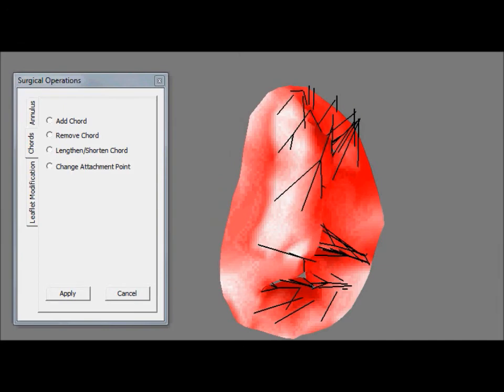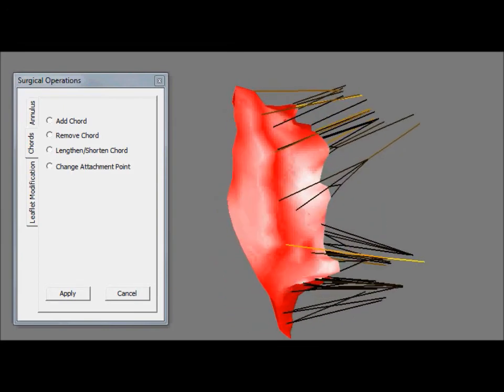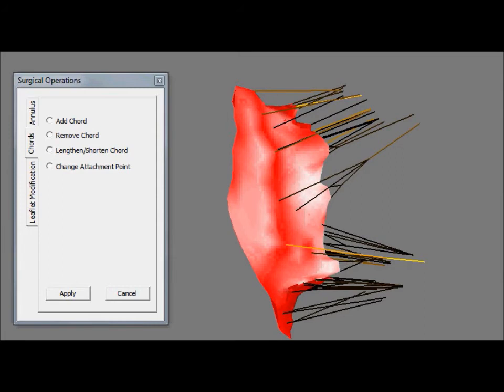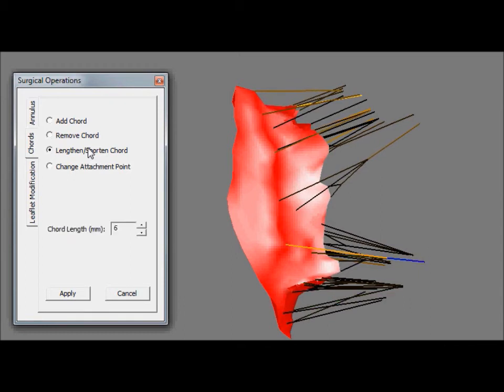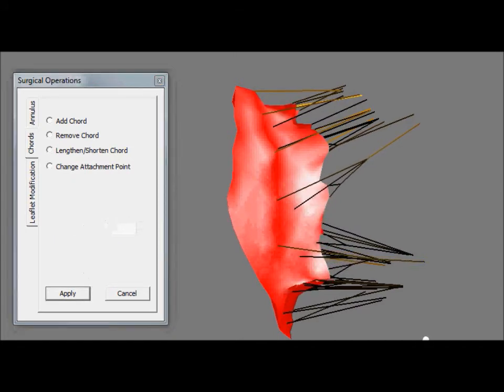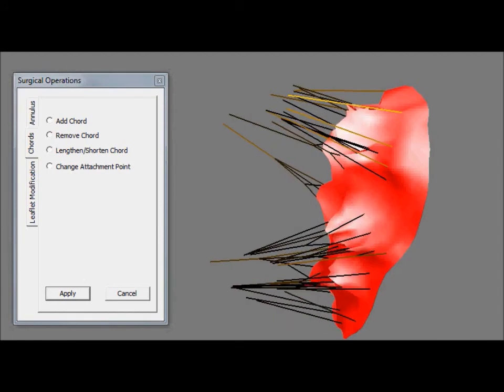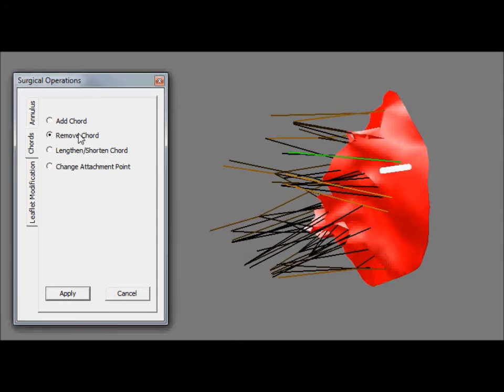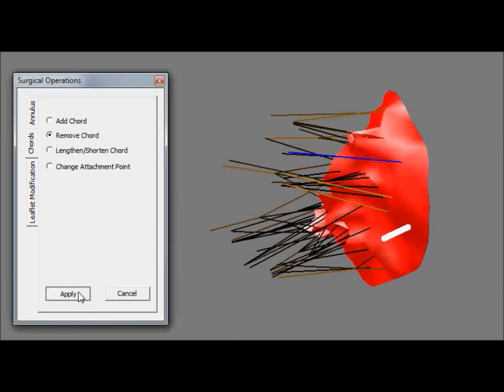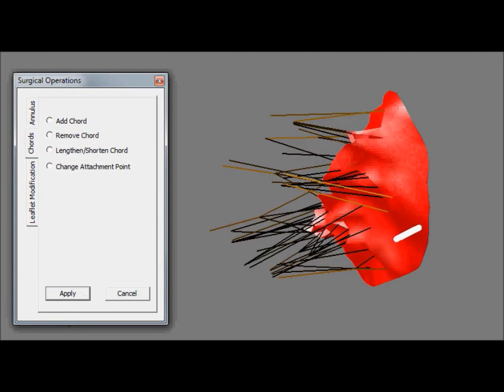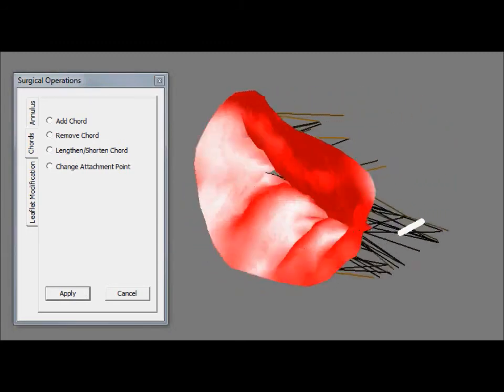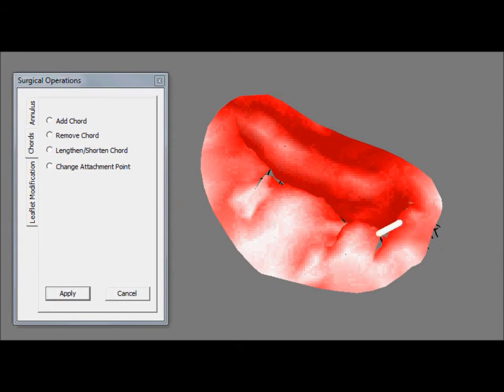Another benefit of virtualization is the ability to highlight the cords experiencing the greatest stress. We select one such cord and decide to lengthen it. The change in valve shape is immediate. Another cord is excised. Nevertheless, regurgitation still persists.